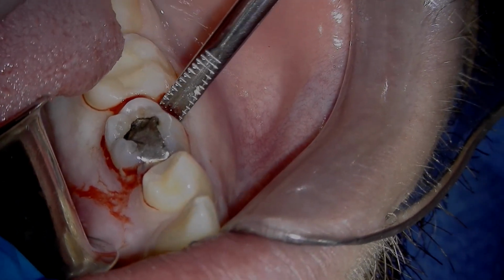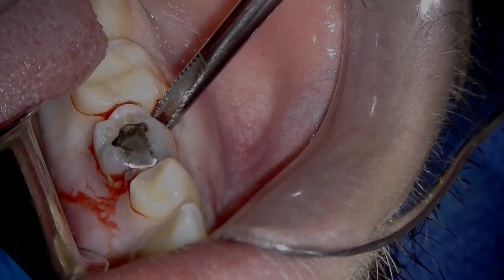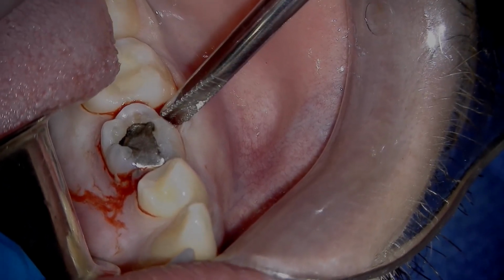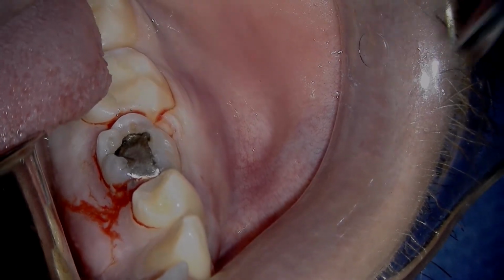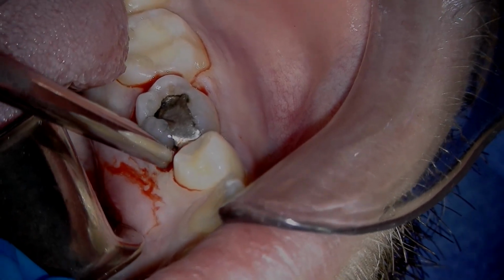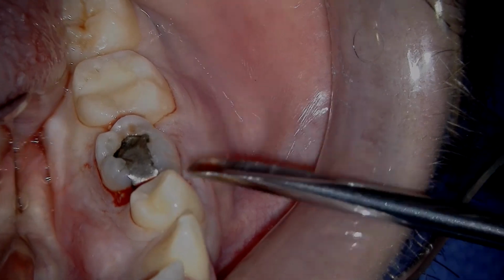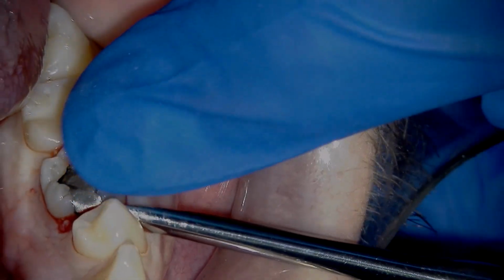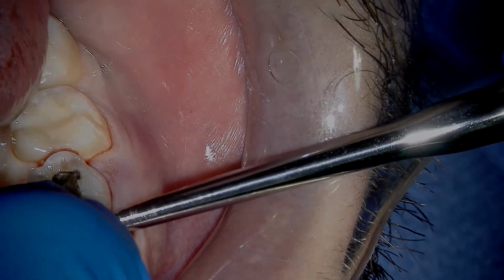And I'm just going to kind of wiggle this tooth around. Come up here to the mesial lingual side here. Make sure this tooth gets loose. Then I'm going to come with a 301 straight elevator and just get a little bit of lift going on, a little bit of expansion of the bone and a little bit of a lift.